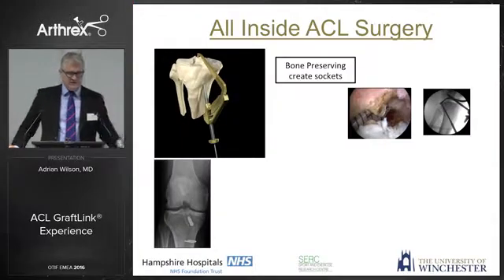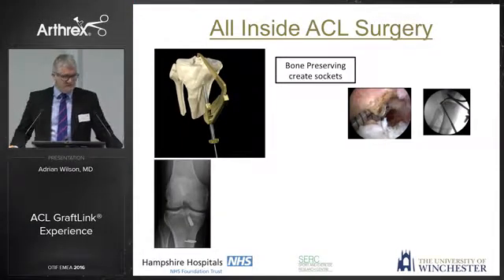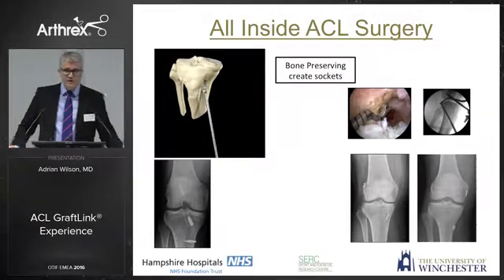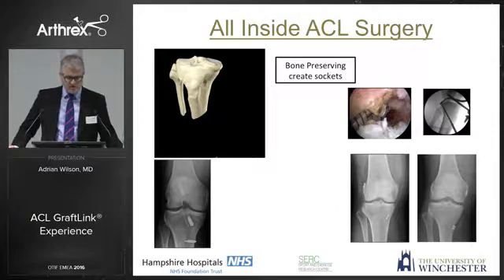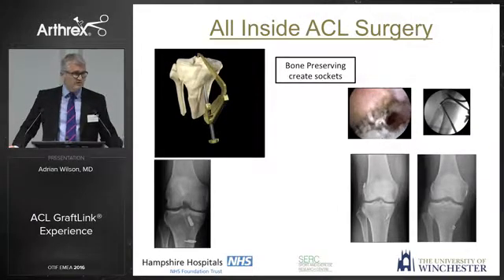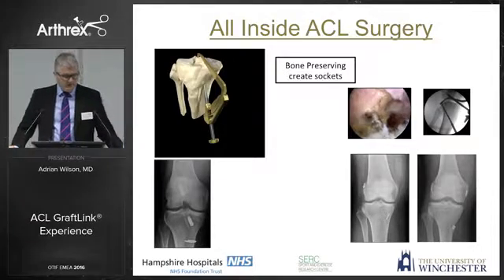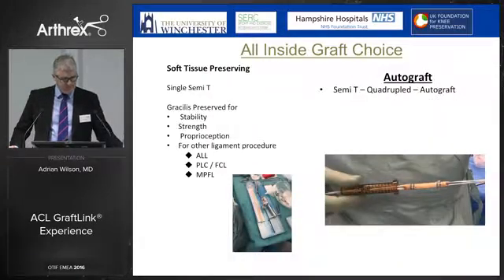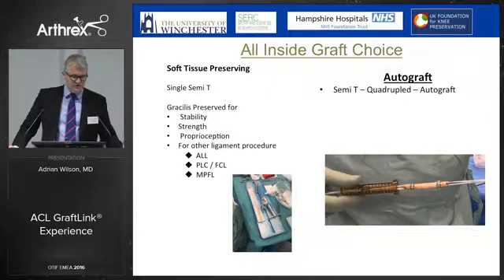So all-inside ACL surgery, everyone in the room is familiar with this concept. The animation that we can see is how we were doing the surgery, making a complete tunnel. What we've moved to is low-profile buttons and sockets, which are bone-preserving, and we're doing this by using the flip cutter. By doing this, we can make a socket as opposed to a tunnel. And we move away from the lower left picture, where we're using screws and staples, to these modern cortical fixation devices. The other main advantage, I would say, is that this procedure is soft tissue preserving.